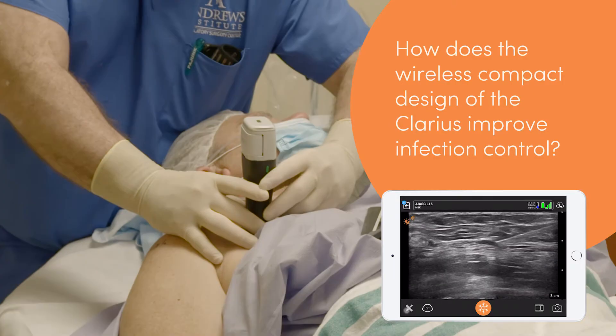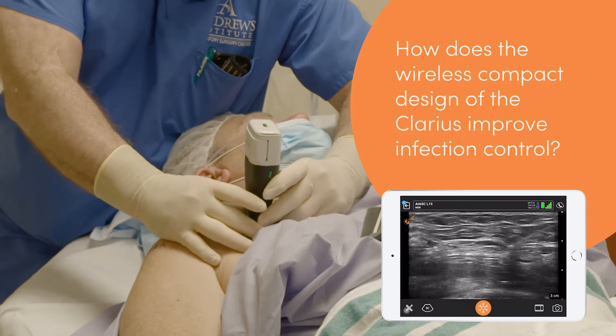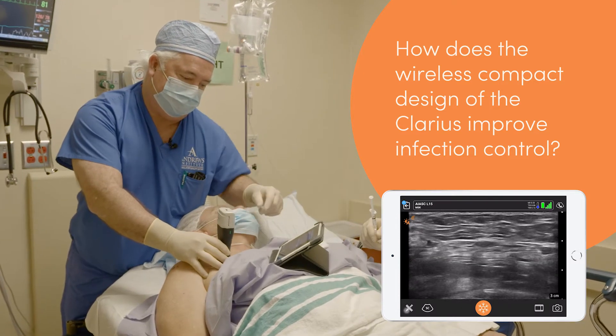When you have a long cable and long sleeve, it's really easy to contaminate those. The ability to hold the whole unit in your hand completely, without wires falling on the patient or across their nose or eyes, is a great advantage. The Clarius probe is so easy to disinfect — all you have is the probe. You don't have the whole cable and tube; just wipe off the contact part and you're done.